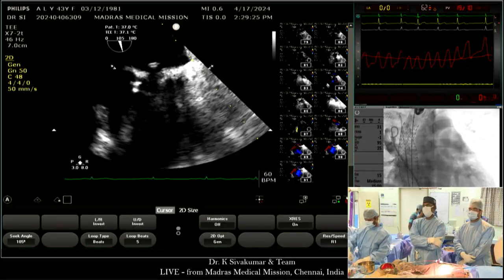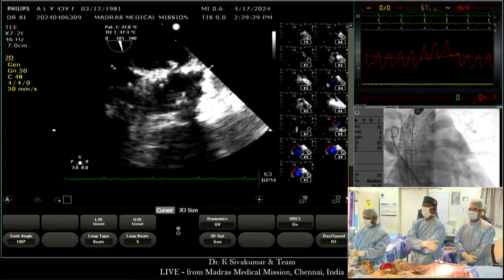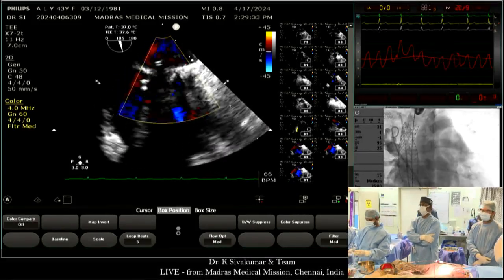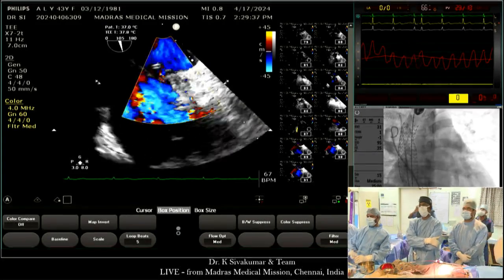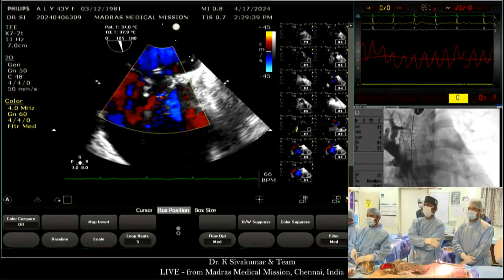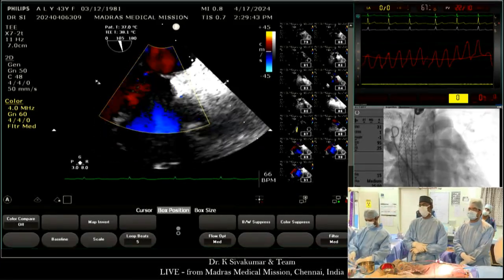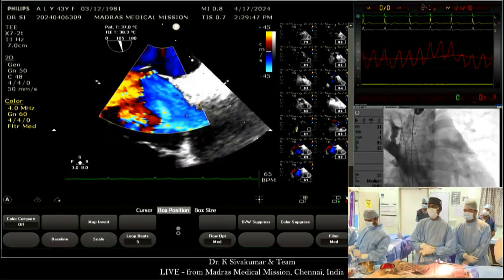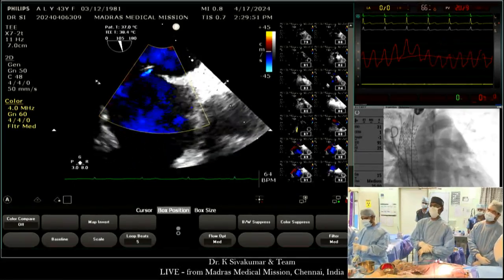Can you explain why the pulmonary veins are so dilated? I mean, they look a bit dilated. Restrictive LV physiology; we are showing that the pulmonary venous pressure now is about 16 millimeters of mercury. When I started, it was somewhere around 8 to 9 millimeters. It has increased to 16. I will give a pullback from the pulmonary vein into the left atrium and right atrium, and you will appreciate that this is a 43-year-old lady having some amount of restrictive LV physiology.